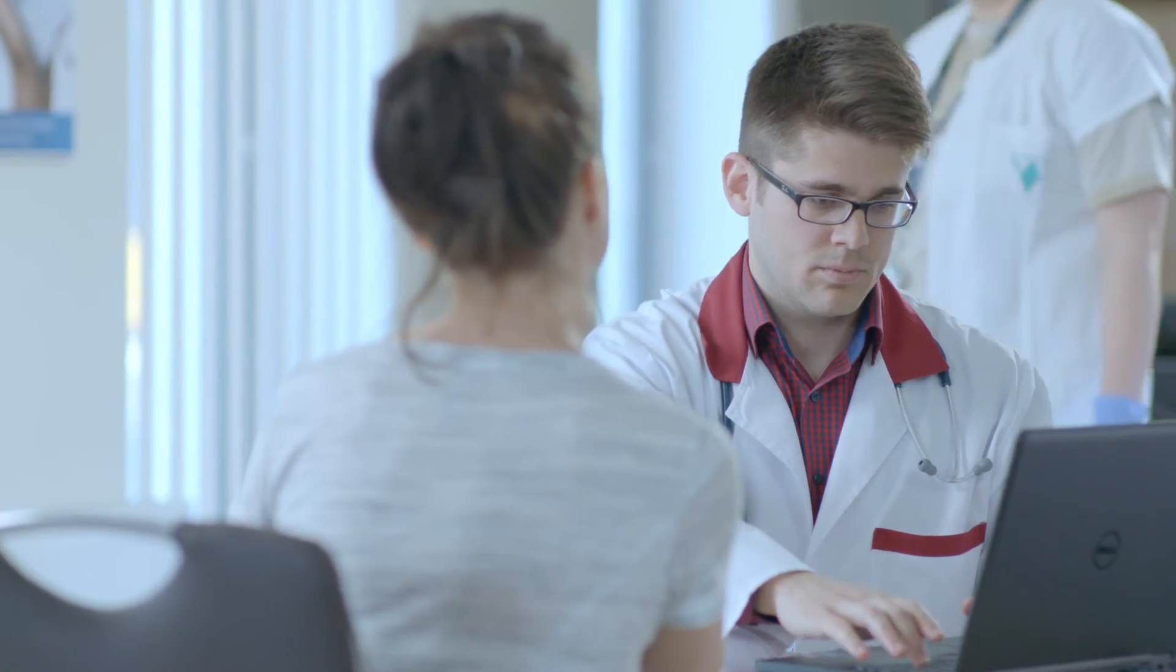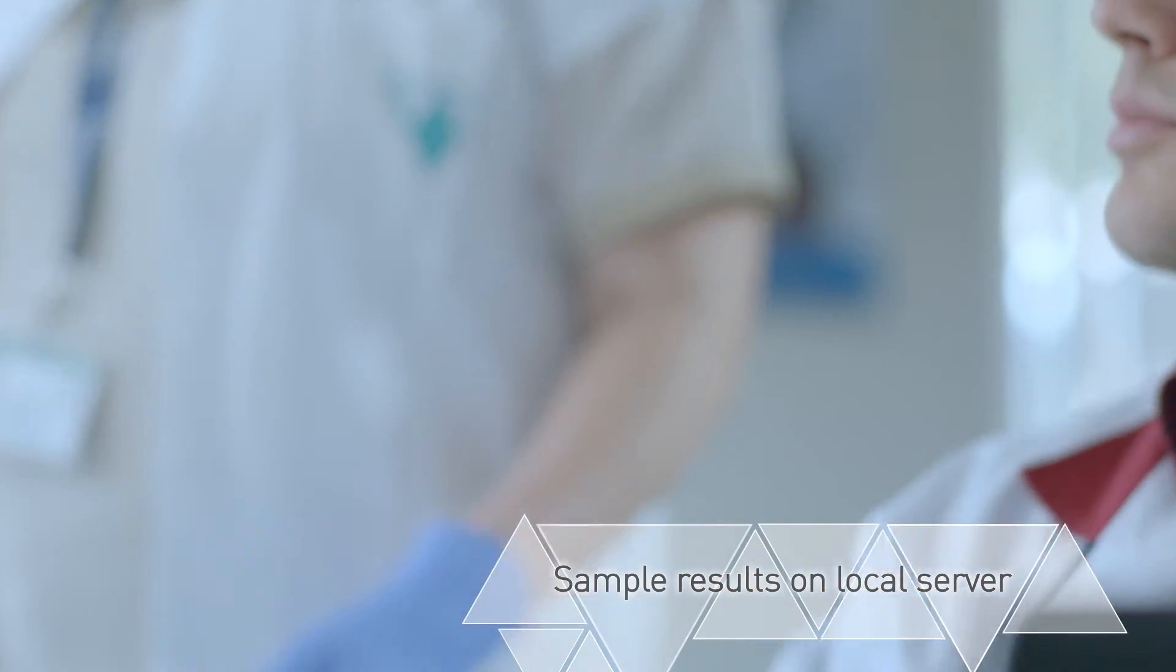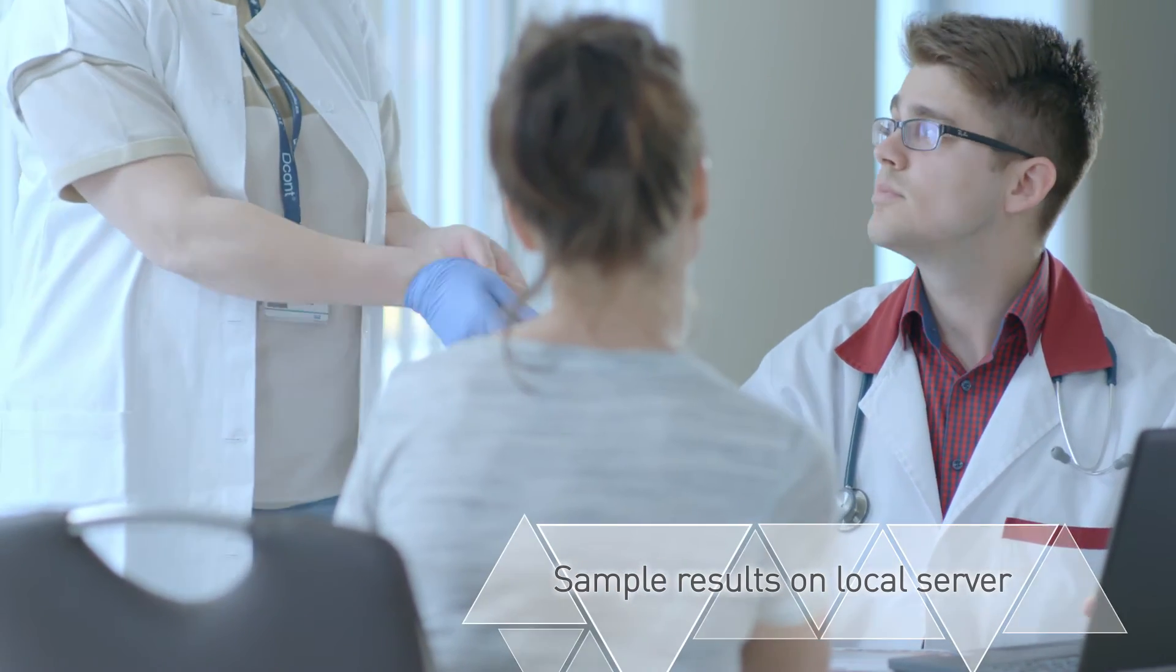DocuReader 2 Pro provides instant outcome of urinalysis helping accurate diagnosis and patient satisfaction.